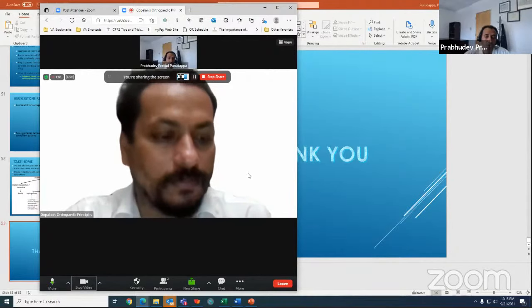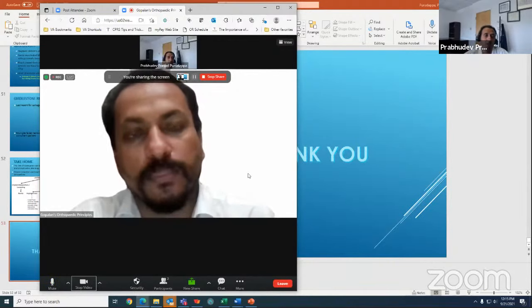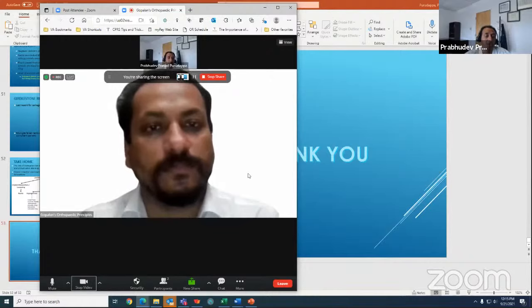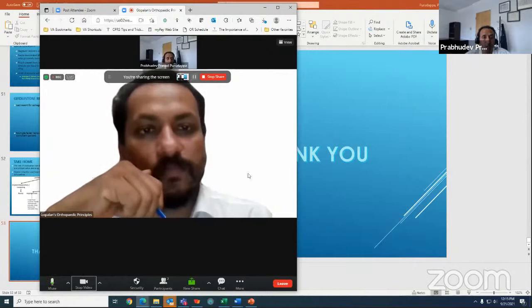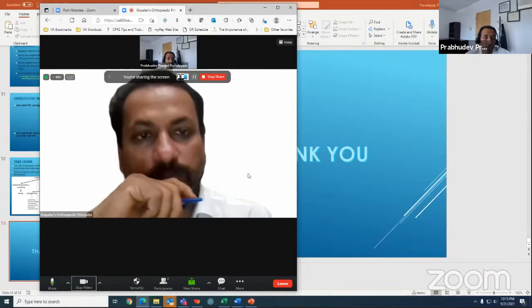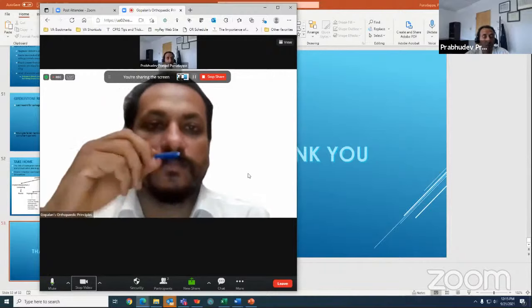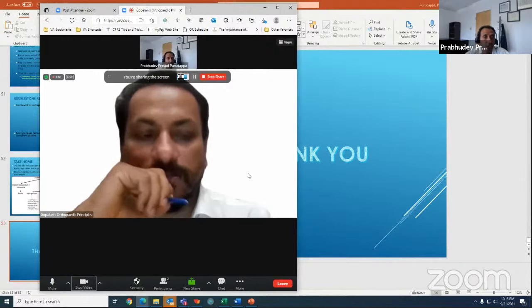Yeah, definitely, that's a good question. Dual mobility, just like the constrained liner, I don't think we should be overusing it. There have been many questions regarding whether we should be using dual mobility in almost everybody. People have looked into that, but I don't think we have enough long-term data. And I'm not aware of that paper, but it does look like during the last 2 decades, since we've been using these larger femoral heads, 32 and maybe even 36, the risk of dislocation and instability has been significantly reduced.